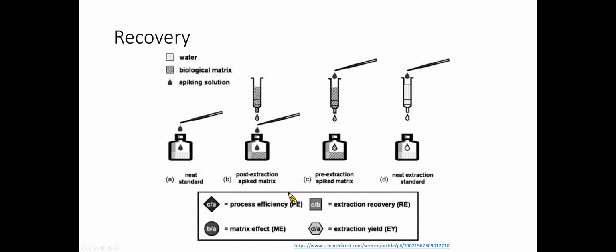Recovery refers to the extraction efficiency of an analytical process, reported as a percentage of the known amount of an analyte carried through the sample extraction and processing steps of the method. Recovery need not be 100%, but the extent of the recovery of an analyte and of the internal standards should be consistent and reproducible. You should perform recovery experiments by comparing the analytical results of extracted samples with corresponding extracts of blanks spiked with the analyte post-extraction.